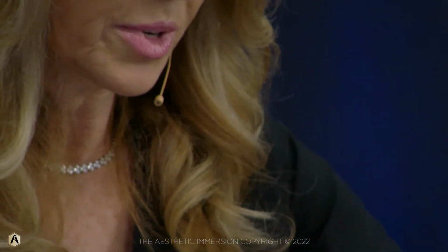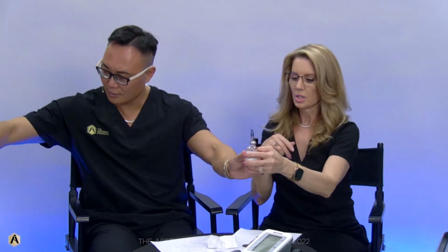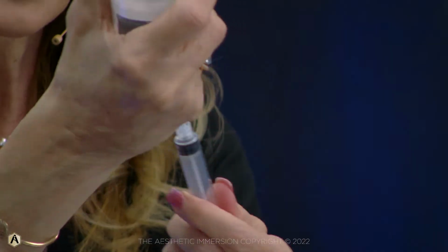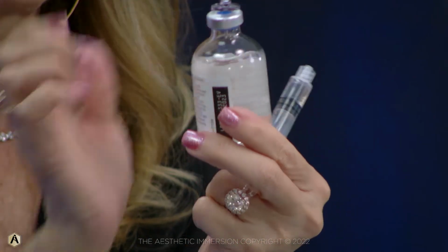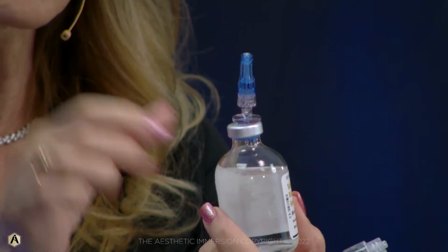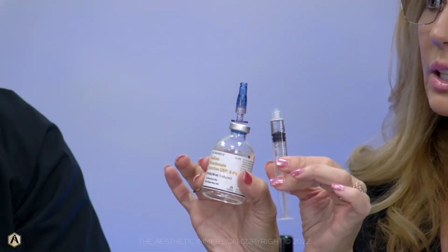So this allows me to take a syringe and just wipe off with an alcohol wipe. And when I want to get, say, my bicarb, I can screw my syringe on here and just pull it out, and when I'm done, unscrew it, and it spring loads right back, and it's all sealed. So you just clean off with the alcohol and pull it out. So you can pull your products out of here really easy.